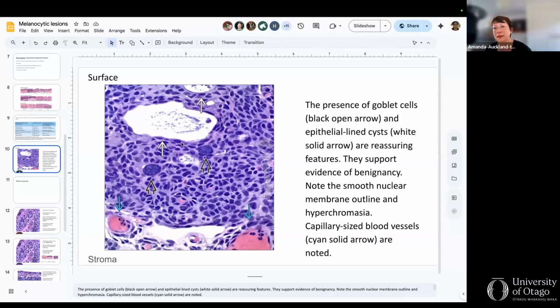Can you tell the difference here between what's epithelial cell and what's a melanocytic cell? It's a bit hard to say. It's really hard, isn't it? Yeah, I can't really tell the difference here. Only years of experience will tell me that this is probably an epithelial cell and these nested ones, but I don't expect you to do this. I'm just going through principles here.